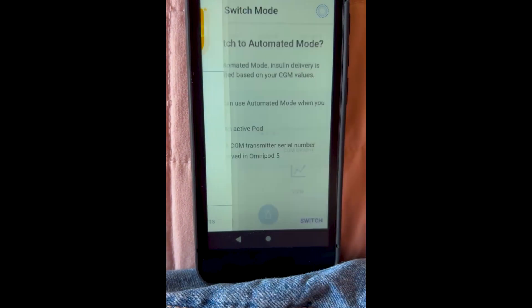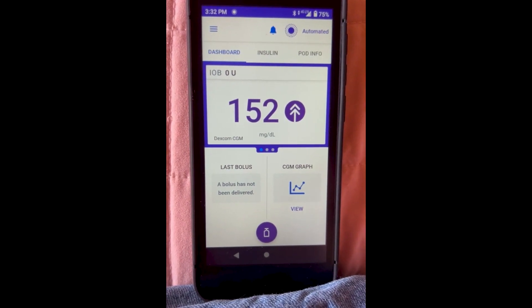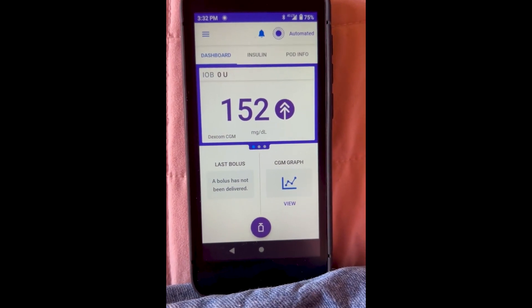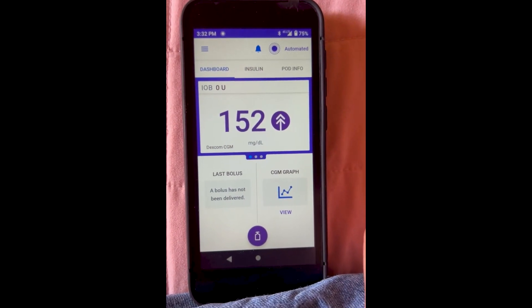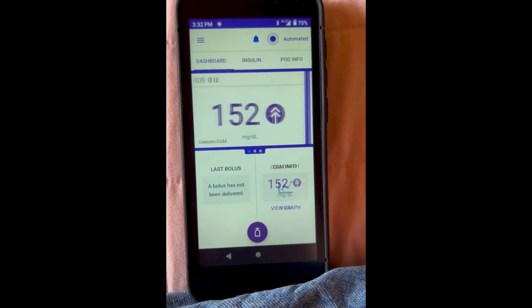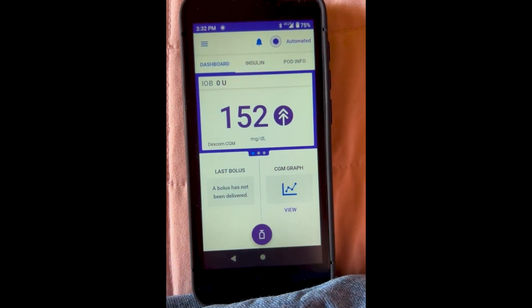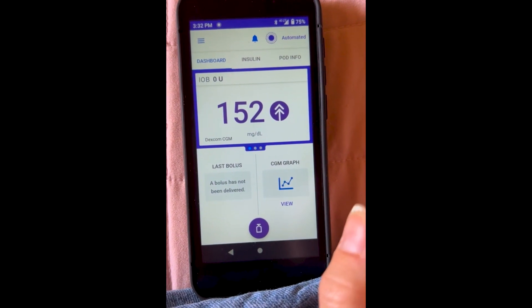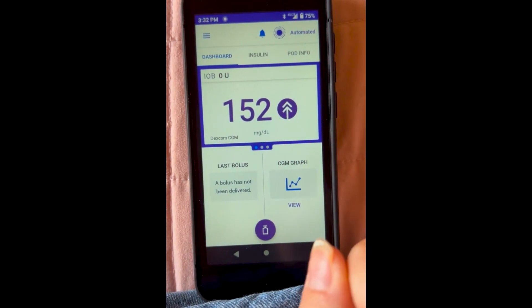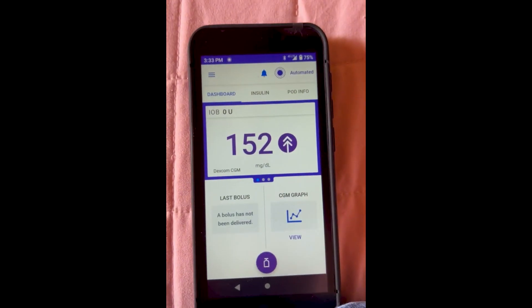Now that it's connected to my Dexcom sensor — it automatically connected without needing a sensor code, which is great — I'm going to switch to automatic mode. I'm going a bit high right now because I overtreated a low. To switch, go to 'switch mode' and press switch. From what I've been told by trainers and people wearing the system, the first 24 to 48 hours it's getting to know you, so you may run a bit above target. Don't throw out your PDM — that's normal. Once past that period, it will start being more aggressive with corrections. Try to start at a time when you're in a stable situation to give Omnipod its best shot.